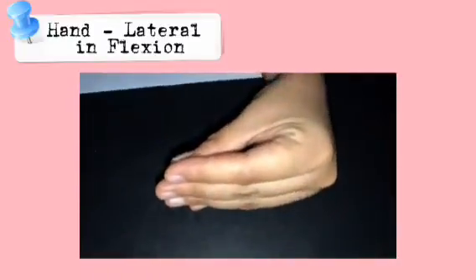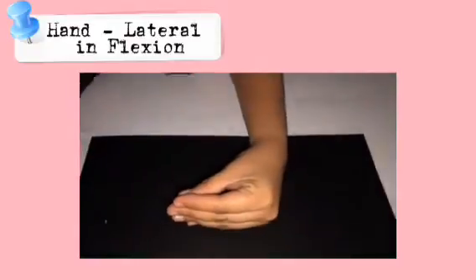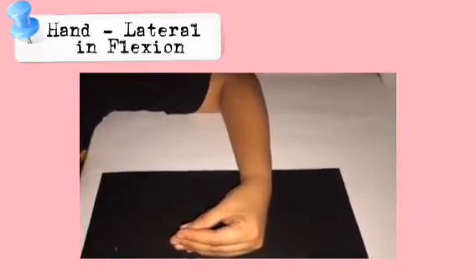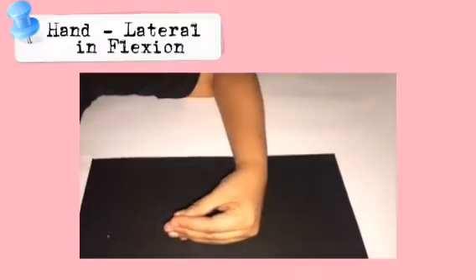Center the IR to the MCP joints and adjust it so that its midline is parallel with the long axis of hand and forearm. With the patient relaxing the digits to maintain the natural arc of the hand, arrange the digits so that they are perfectly superimposed. Have the patient hold the thumb parallel with the IR or, if necessary, immobilize the thumb with tape or sponge. The central ray is perpendicular to the MCP joints, entering the MCP joint of the second digit.